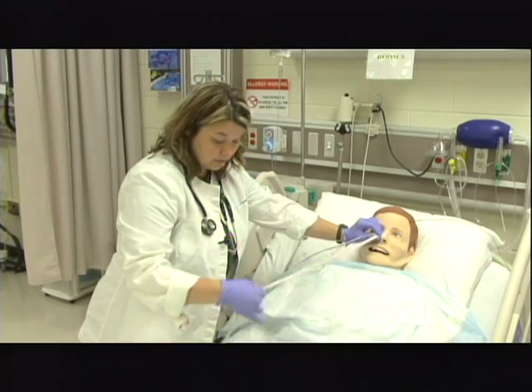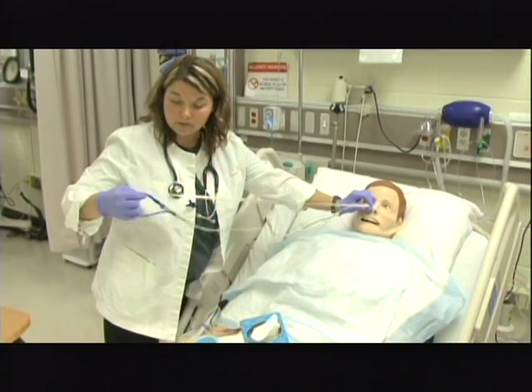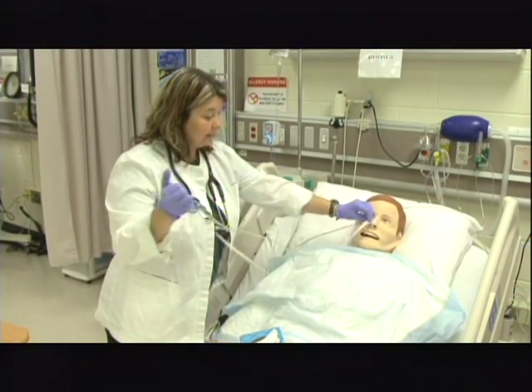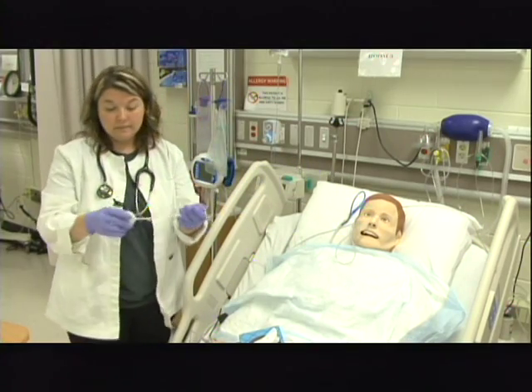I'm going to straighten out the measurement and measure all the way down to the very end of the tube with it completely lengthened. And I'm confirming that this is 79.5 here with it lengthened out. I'm going to then place it back up above the level of the patient's stomach.